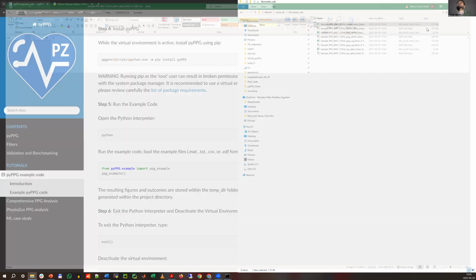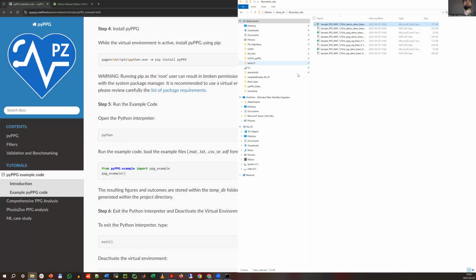It's a derived biomarkers. It's the second category. The higher derivatives also have a type of biomarkers, and the different combination of these higher derivatives is the fourth category.